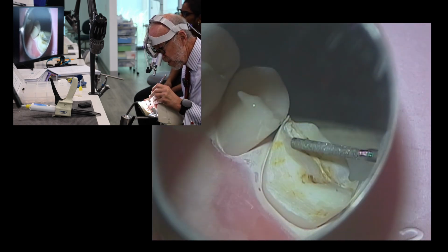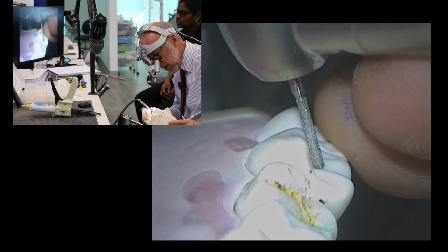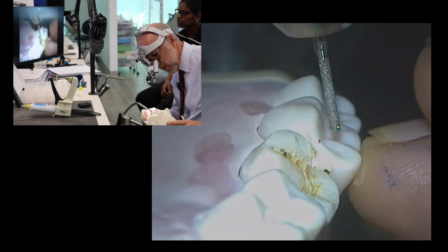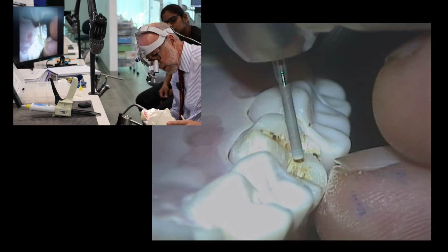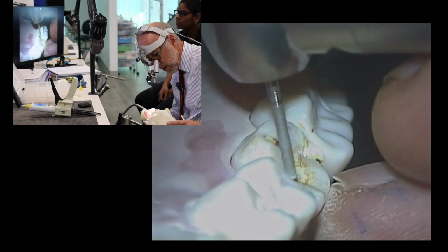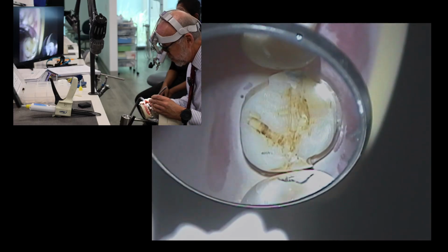Now, this plane here on the B plane, you're going to do that by direct vision, right? Yeah. And you're going to do it by direct vision so you can see the angle compared to the adjacent tooth. See how horizontal you're making it? Okay. You want this angle from the marginal ridge straight through the oblique ridge, and just follow the central groove straight through the oblique ridge. So you've over-reduced the occlusal part of this plane because you had it too horizontal. Watch the vertical angle.